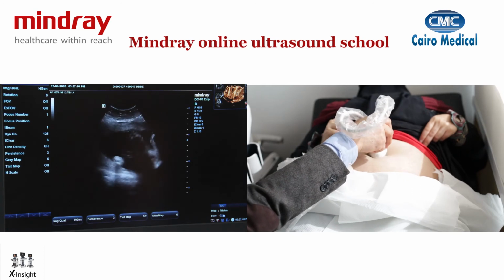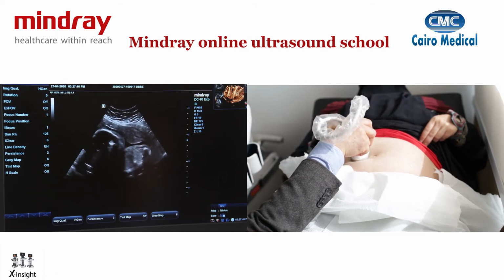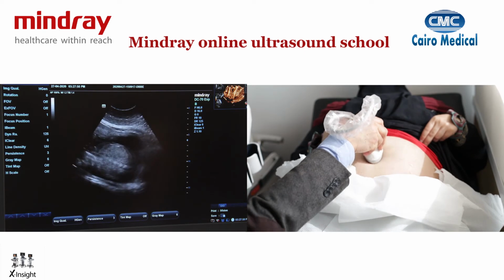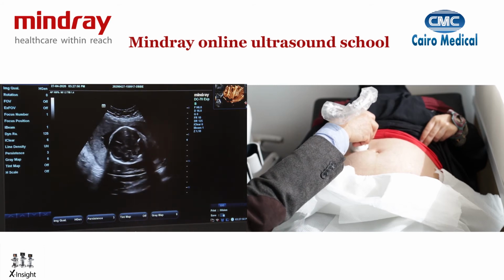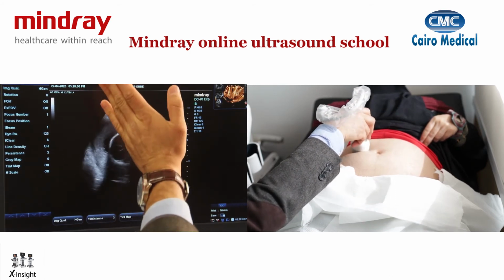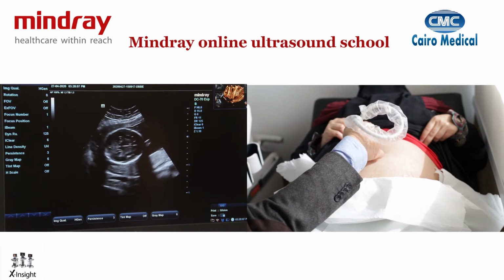But before we do that, let's have a way of actually handling and sweeping across the baby's body so you can actually get the views. And the best way to do is, first of all, put your probe at a 90 degrees angle, move upwards until you find the midline echo of the baby's brain. As you can see it here, that's the midline echo. I'm going to move my hand at a 90 degrees angle, so instead of scanning longitudinal, I'm going to be scanning transverse.